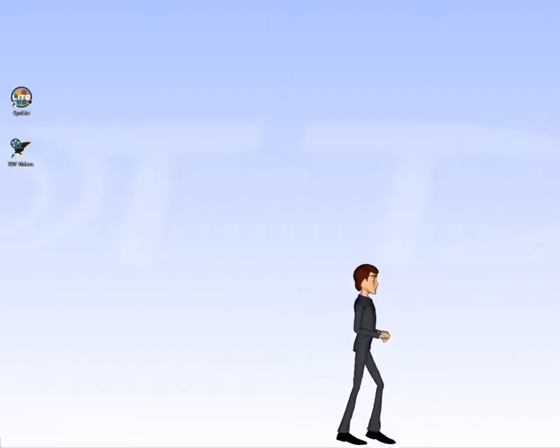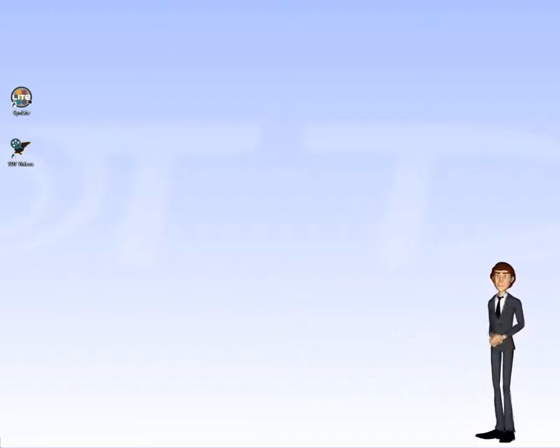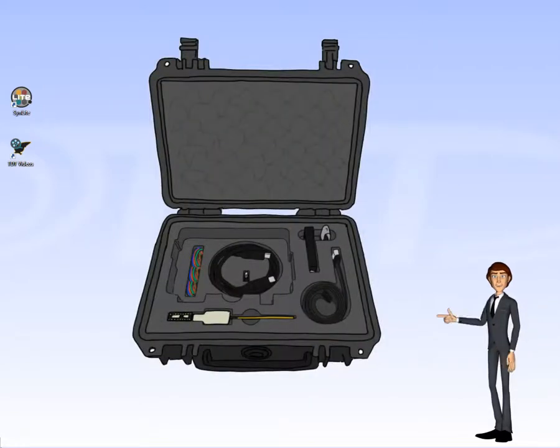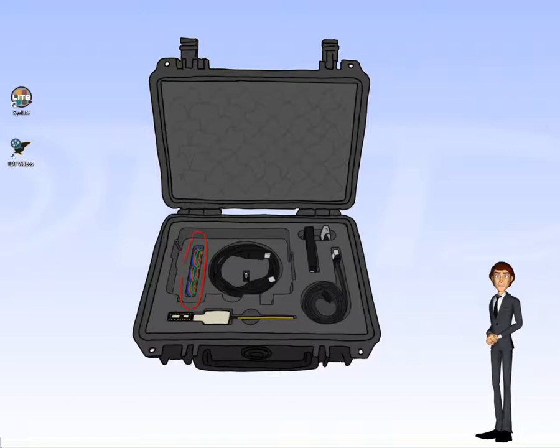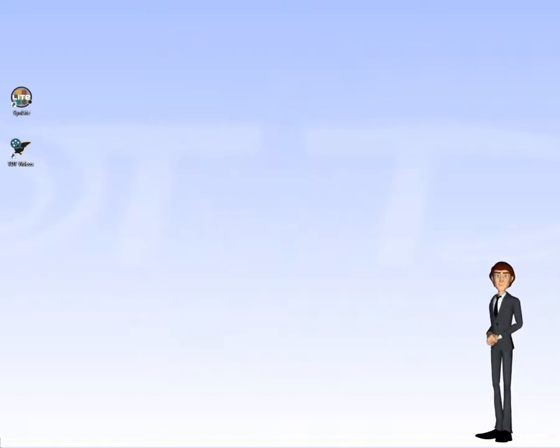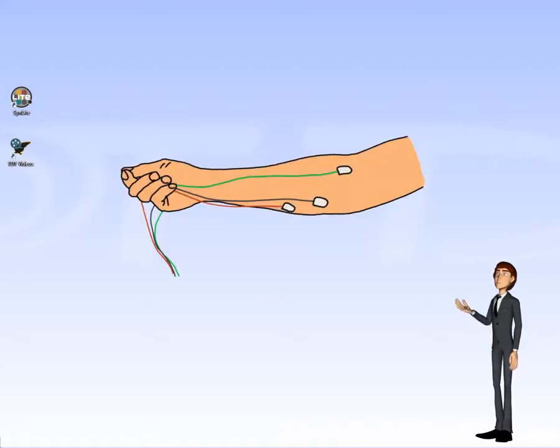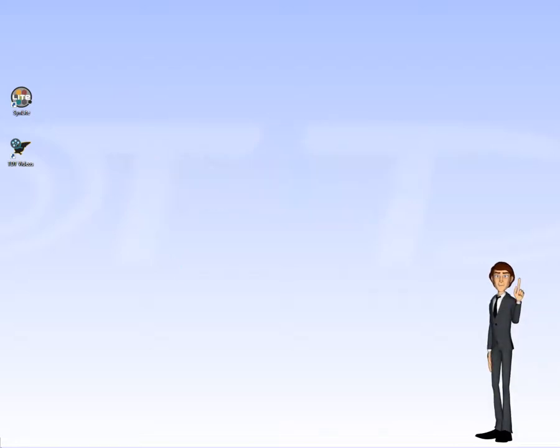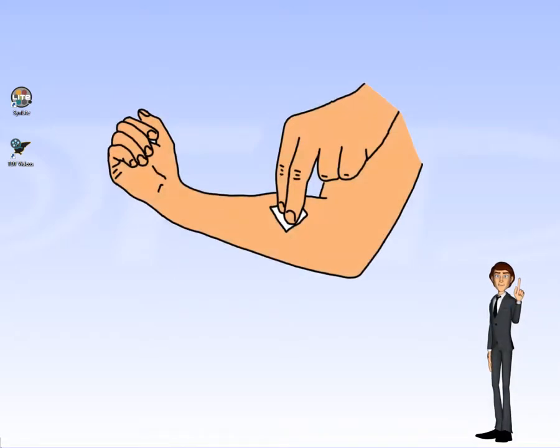In this experiment, we are going to record electrical signals from the muscles in your forearm. Your LabRat kit comes with a set of disposable electrodes and an alcohol wipe to prep the skin. Collecting these signals is pretty easy. You'll want to place the electrodes about like this. The exact location is not crucial, however, preparing the skin before placing the electrodes is important to getting good clean muscle signals.